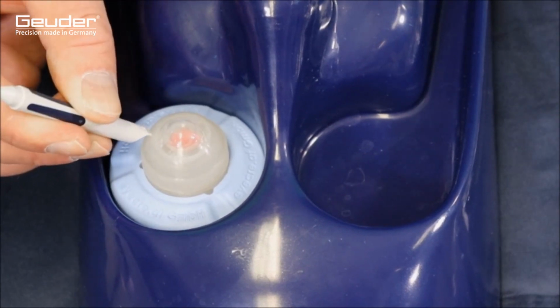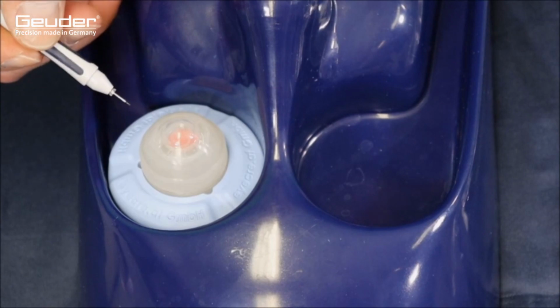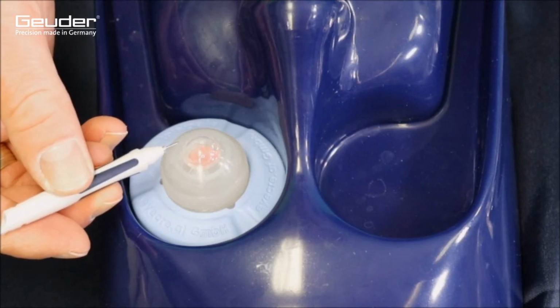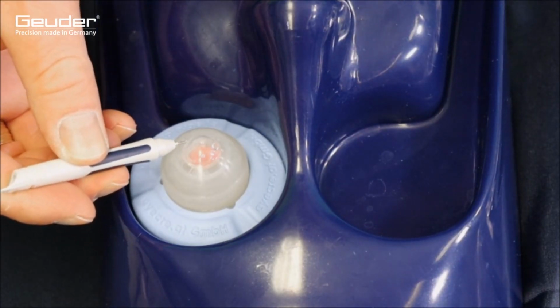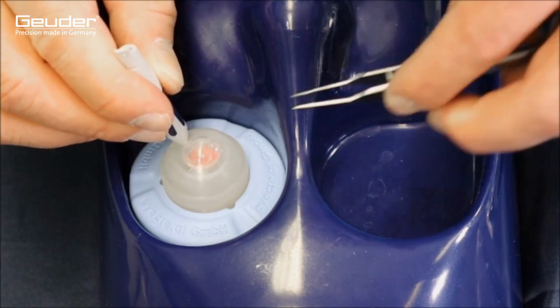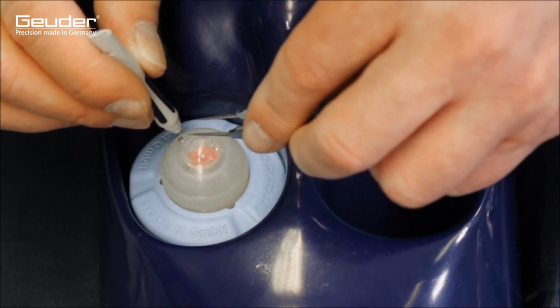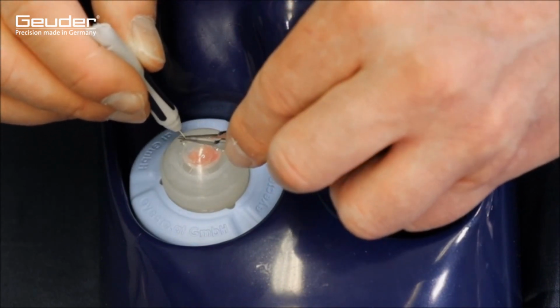The introduction of the trocar lance is initially carried out at an angle of 5 degrees until about half of the sclera thickness is reached. The lance is then raised to about 30 degrees to the sclera and the sclerotomy is finalized. The trocar port is secured with forceps and the lance removed.